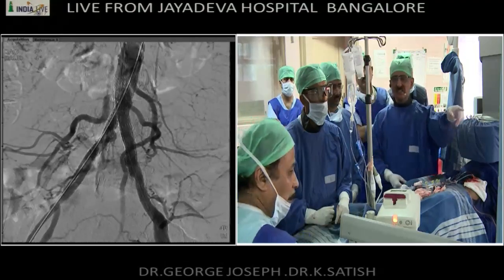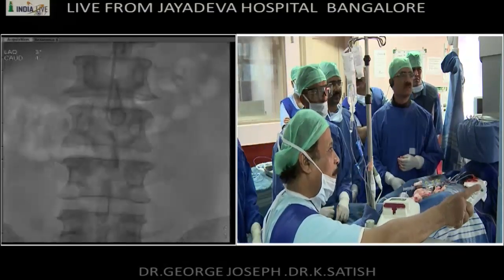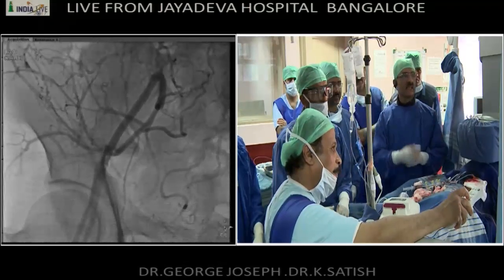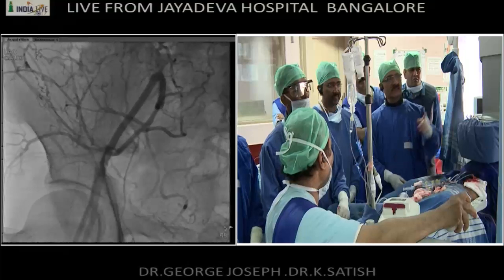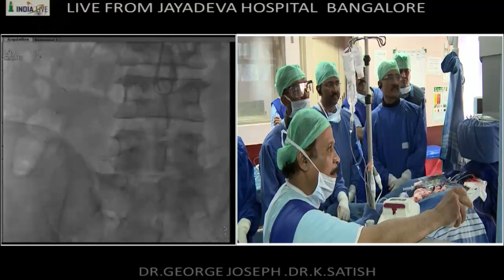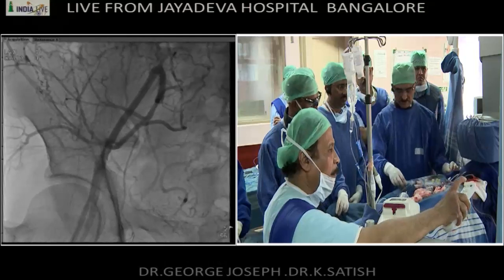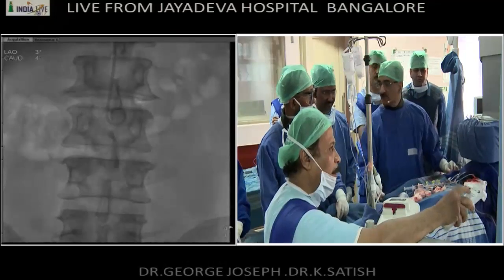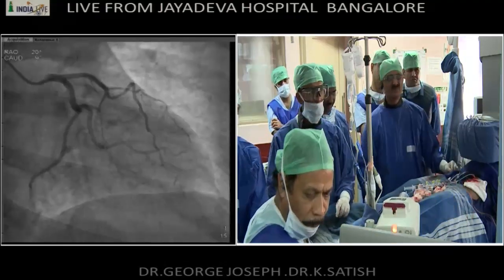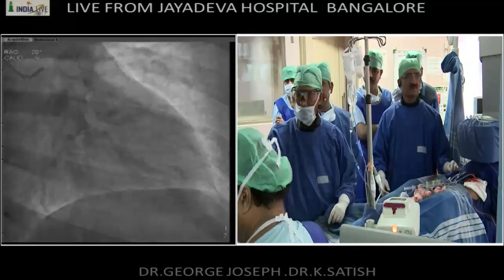We'll show you the baseline angio. Go forward to the next one. Yeah, this one. So it's quite okay there. So you can see that the CTO starts exactly at the bifurcation. All right, we may have to. A self-expanding 8 by 60 millimeter would do, I think. A small dissection flap distally, so I think it is better to extend. Show the last picture now, the last pigtail angio.